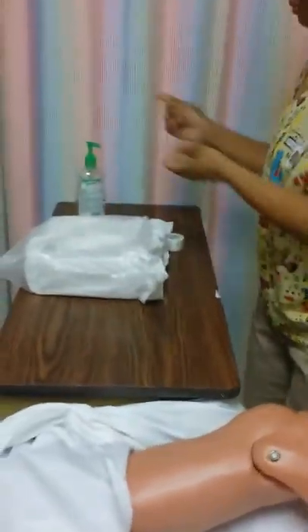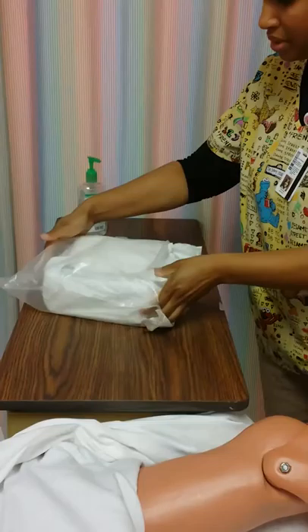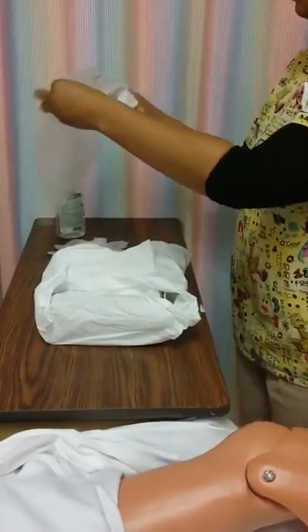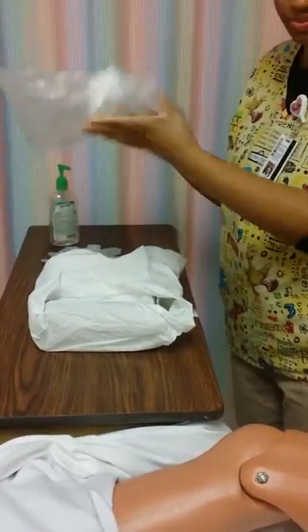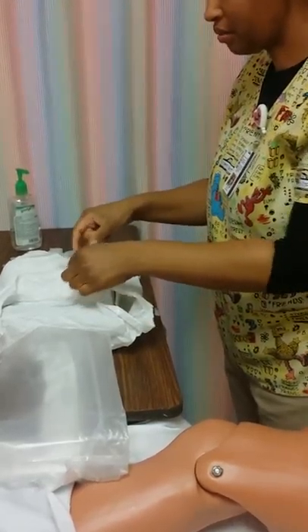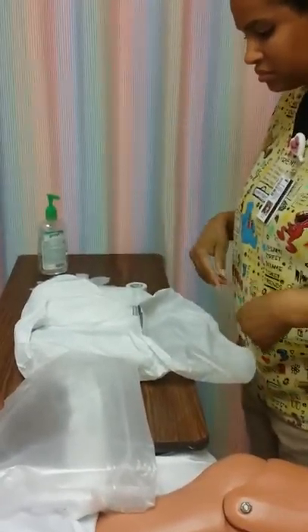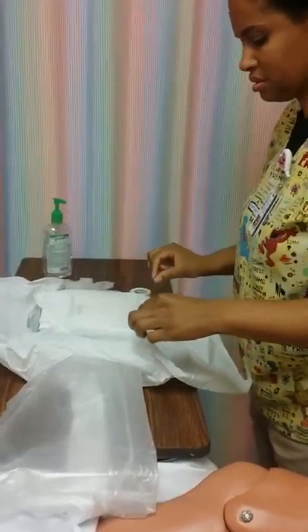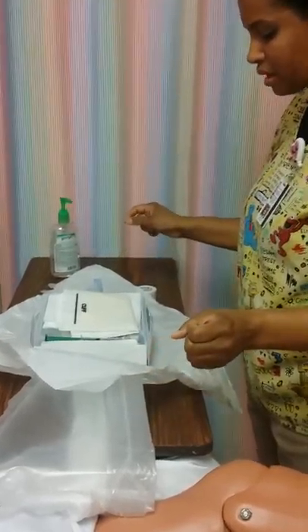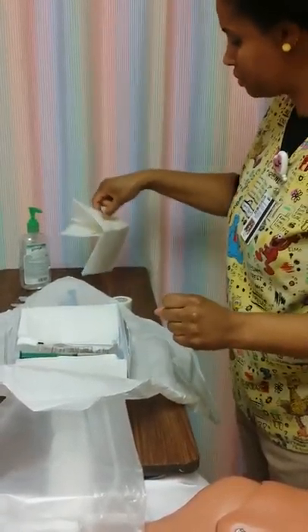I'm going to clean my hands again. And then I'm going to open my sterile Foley catheter kit. Now, it's good to have a bag just beside for trash, so we'll use that as trash today. And then I'll unwrap it, side down, just holding the edge so we can maintain our sterile field. Okay, so then I'll take my gloves out. Okay, it's to the side.